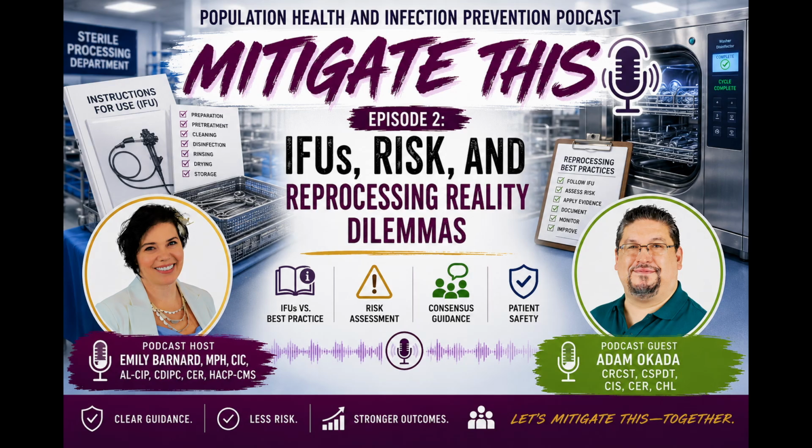There's different pieces throughout, and it can read a little bit like stereo instructions. But can you give tips on how to dive into those IFUs in a meaningful way that you can be more informed about these instruments coming into your organization? I think access is going to be the most important thing. You have to have access to your instructions for use for every device that's coming into the facility.